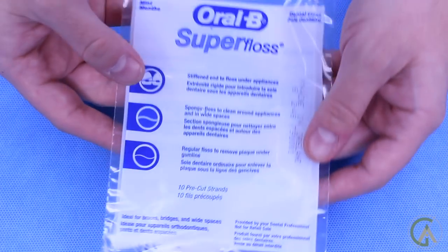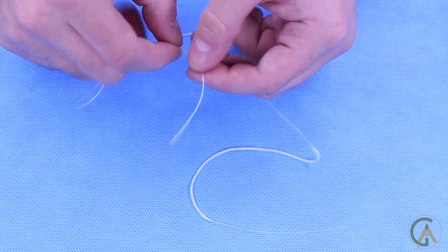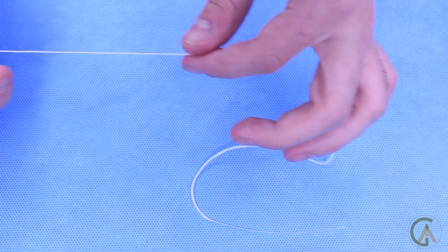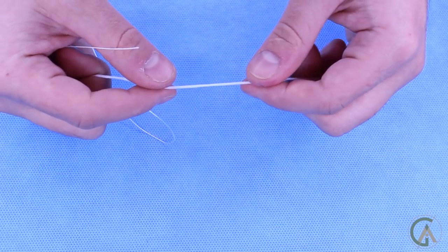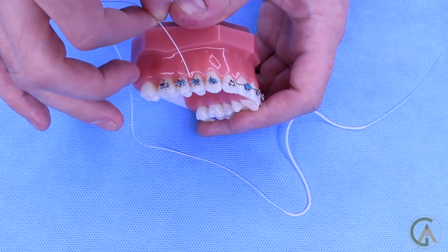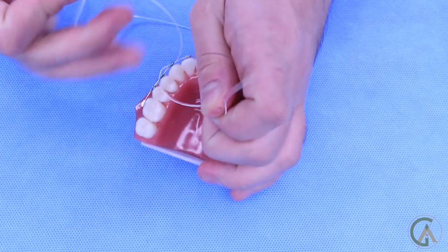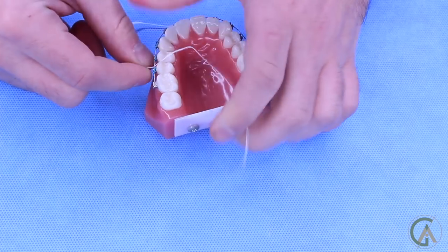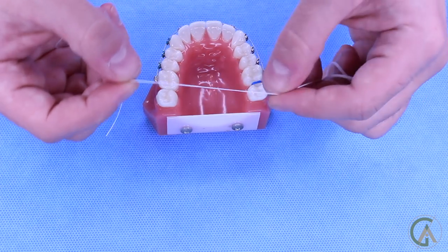Another product you can use is Super Floss, which actually has the threader built into it. It comes in a pack, and there are three parts to this floss: the part that is the threader, which is a little bit hard; a section of normal floss; and a part that's a little bit softer and cushier, which is for larger spans or to clean around the braces. Since it already has the threader built in, you can just run it straight between the teeth. You can use the thicker part for bigger gaps and the regular floss section for all other areas.